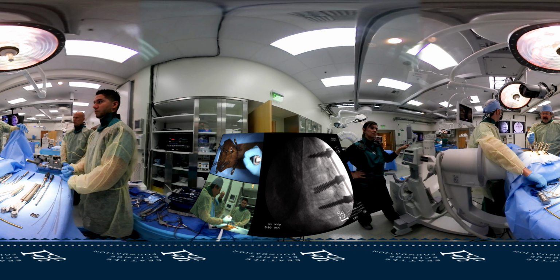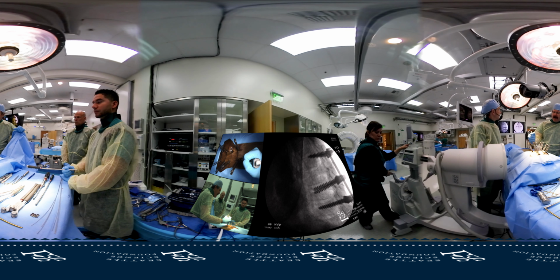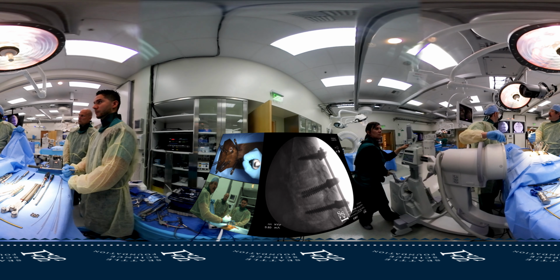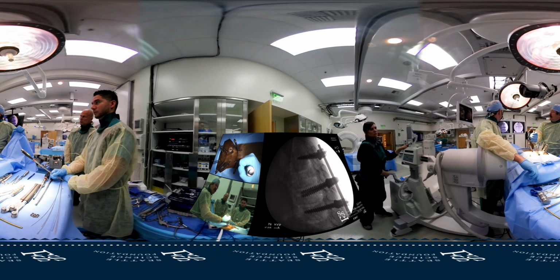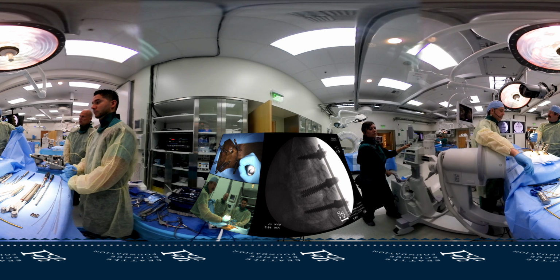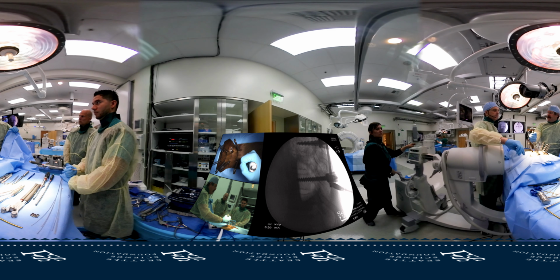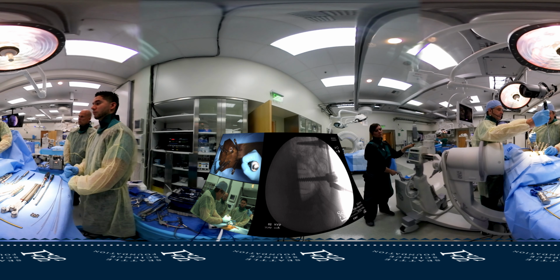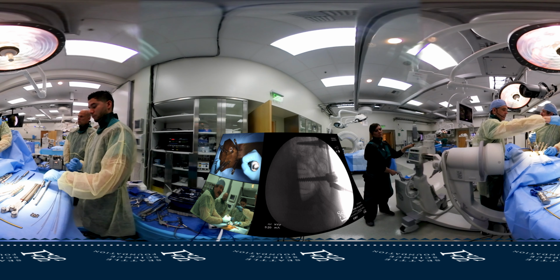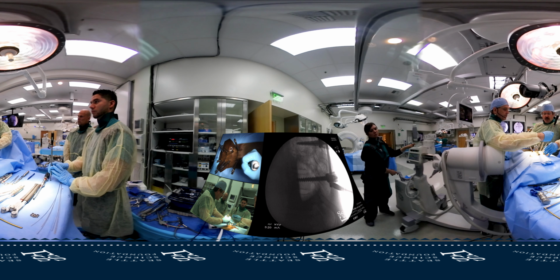And if you look, come to the top here. So I'll verify that I have my rod all the way through at the top. And I do. I probably could give it a little more room. Picture. So I'm safe. Come to the bottom. Picture. And I'm safe there. So I should be pretty good. As that squeezes down, there'll be more room for the rod. And it doesn't matter which side I start on. It also looks like my contour is going to be pretty good. So I'll start squeezing the rod down.